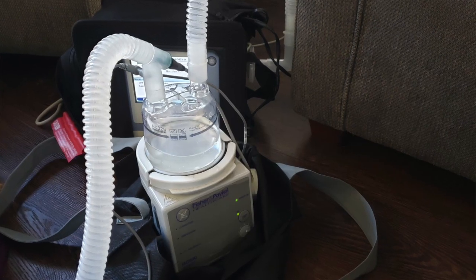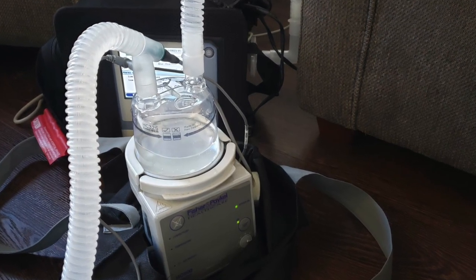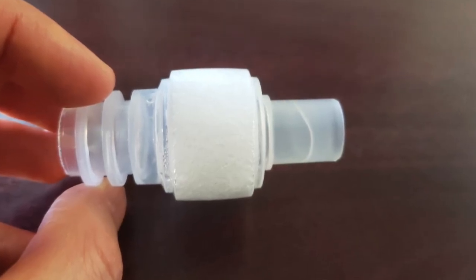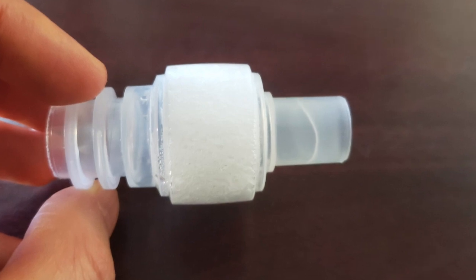My lungs are extremely dry from a long day of traveling. I have my heated humidifier running to restore moisture back to my lungs. Although I wore a heat and moisture exchanger for the entire time I was traveling, my lungs are very dehydrated. I'm going to run 5 to 10 milliliters of saline through my nebulizer to help loosen up the mucus which has accumulated in my tracheostomy tube.